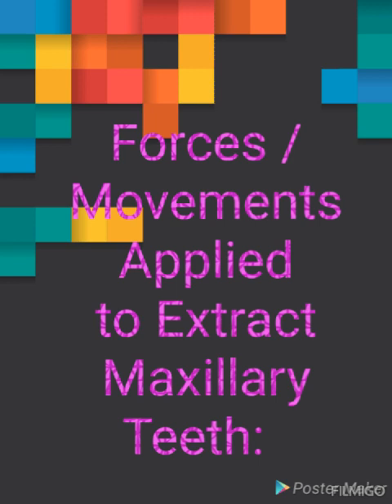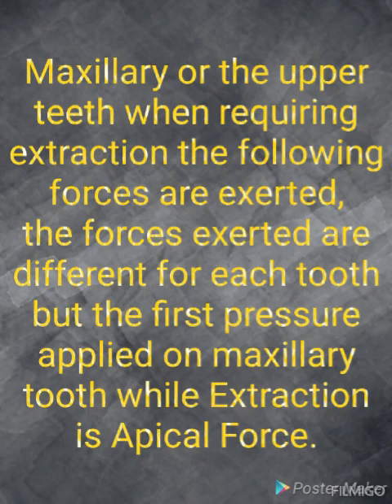So the first one is the maxillary, or upper, teeth. When requiring extraction, the following forces are exerted, and the forces exerted are different for each tooth. But the first pressure applied on a maxillary tooth during extraction is apical force. This is very important. The first force in maxillary teeth we have to apply is apical force.